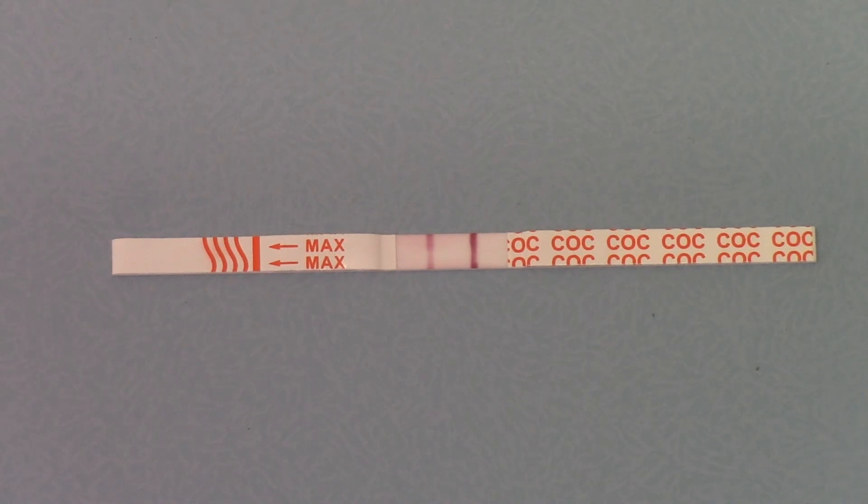That's the Ultra Cocaine Test Strip available from UK Drug Testing. These are available in packs of one, five, and the full pro cartons of 50 test strips from the UK Drug Testing website.